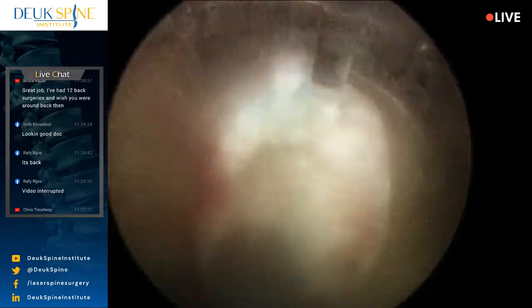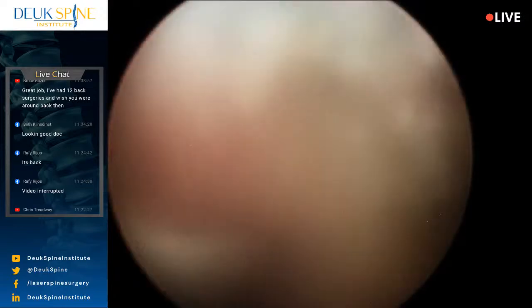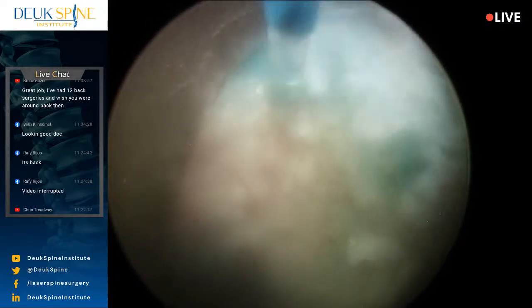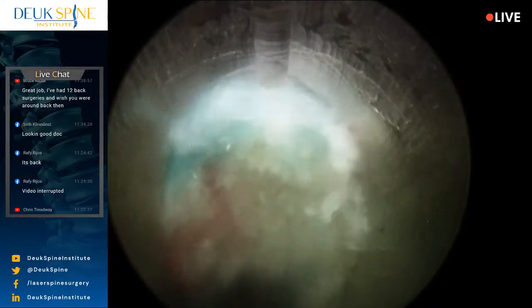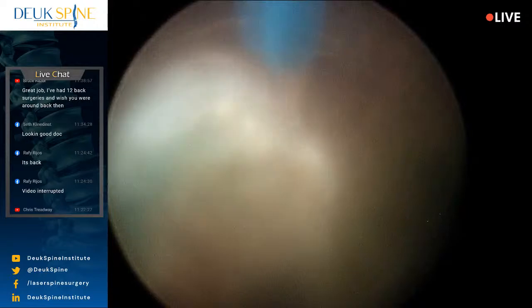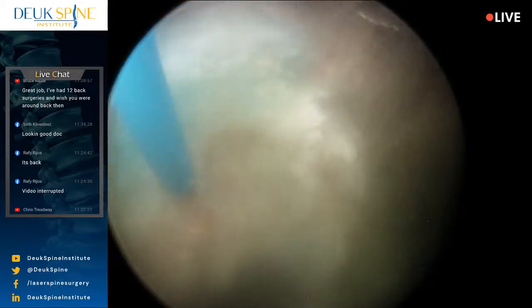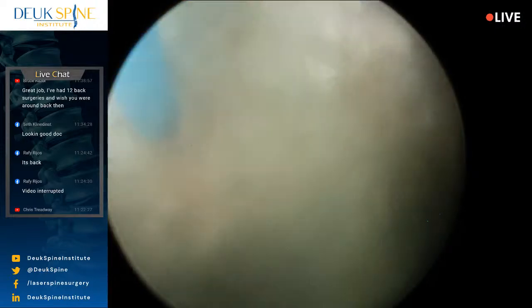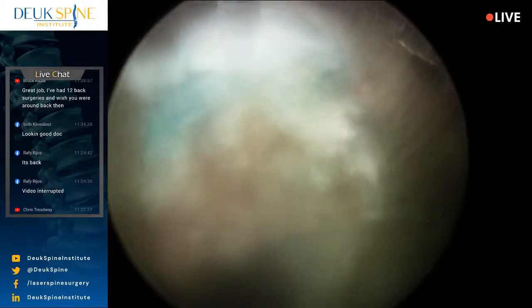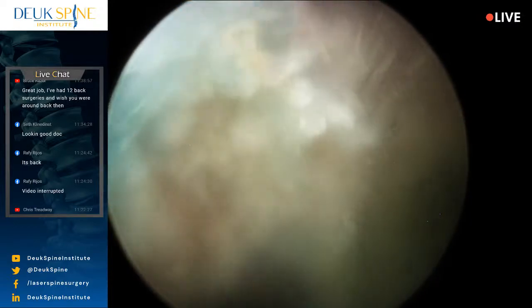And it reminds us that this is an inflammatory condition. Herniated discs and pain from the herniated disc is inflammatory. It's due to the inflammation in this area. And she had a lot of inflammation here because she had a lot of pain, and the pain indicates inflammation. This is all herniated disc right here. And yes, this looks like it could be 6 months old. That's for sure, which is when she said her symptoms began.